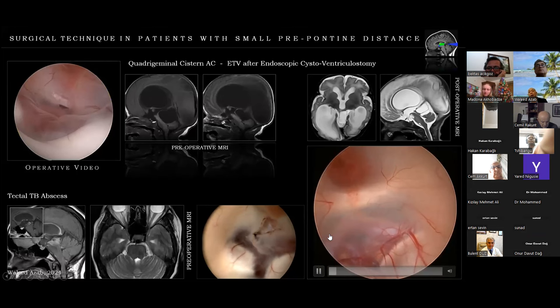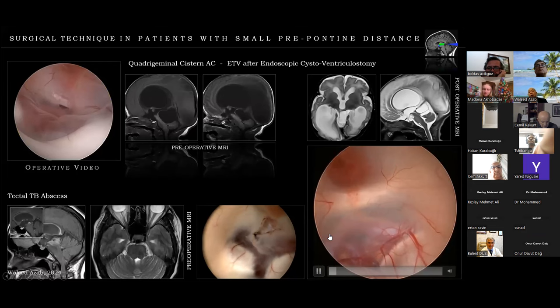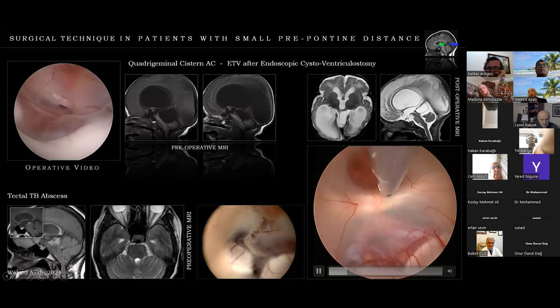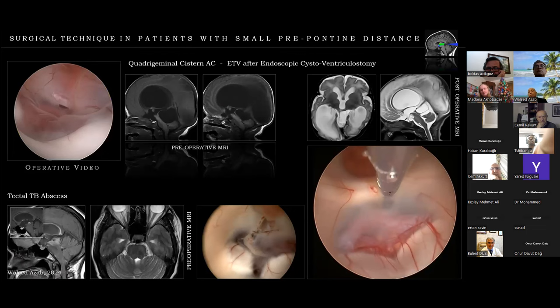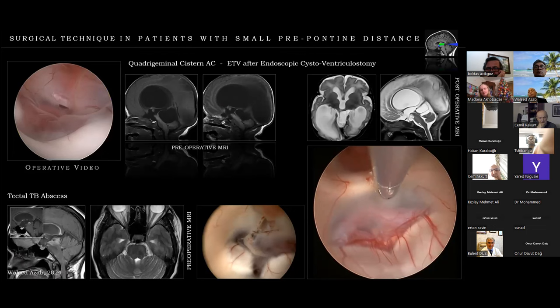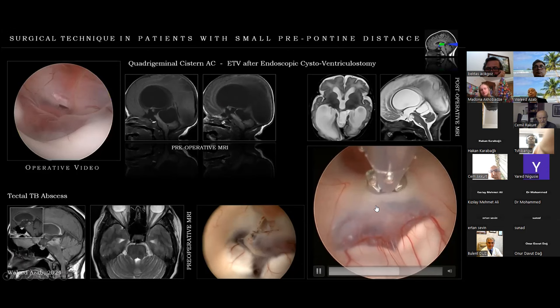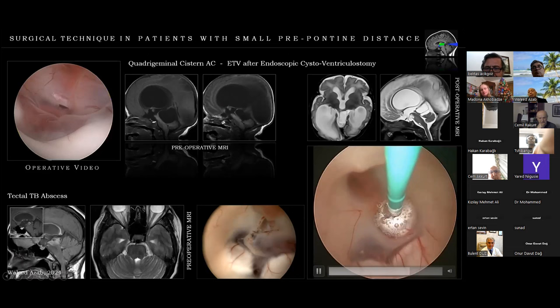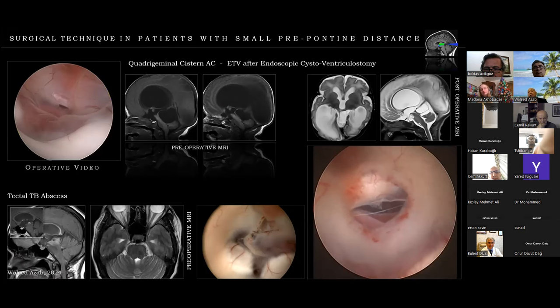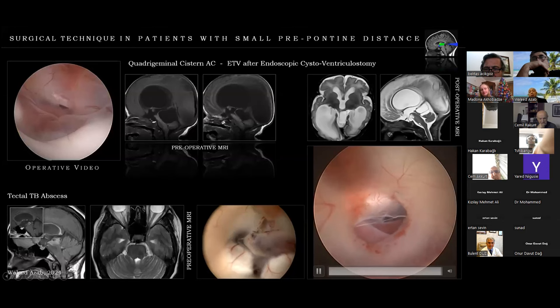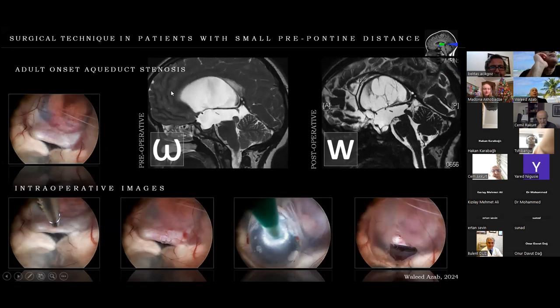Here is the final opening. One more example: the two P1s are very close to the dorsum sellae with just a very small clear area. It was felt safer to open the floor against the dorsum — just a small pop with the instrument flush with the dorsum sellae — then the forceps is opened to increase the opening, and the Fogarty catheter enlarges the opening in the standard way. The P1 and superior cerebellar artery are seen through the opening.